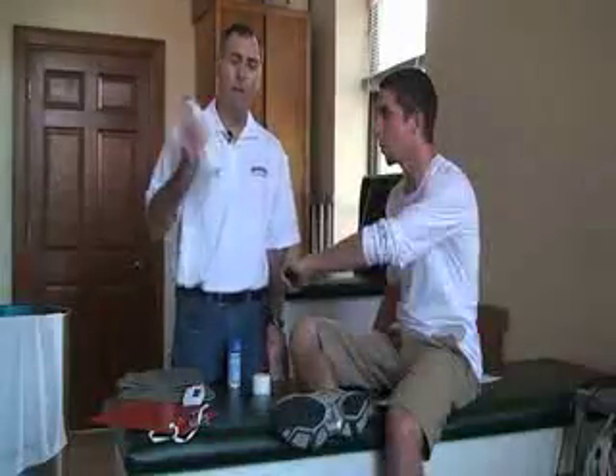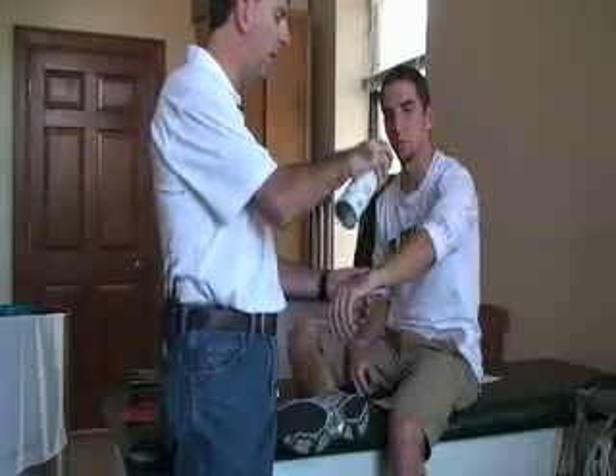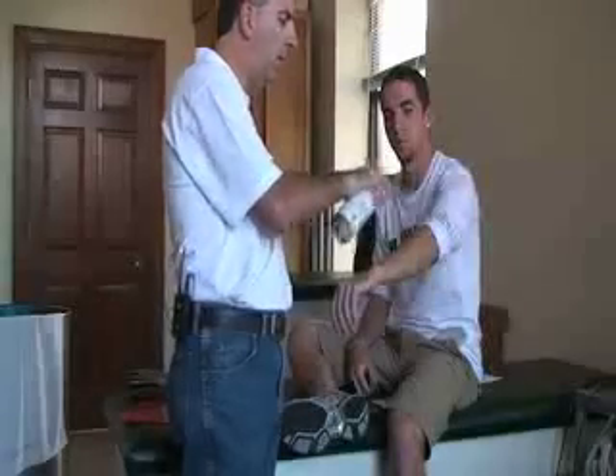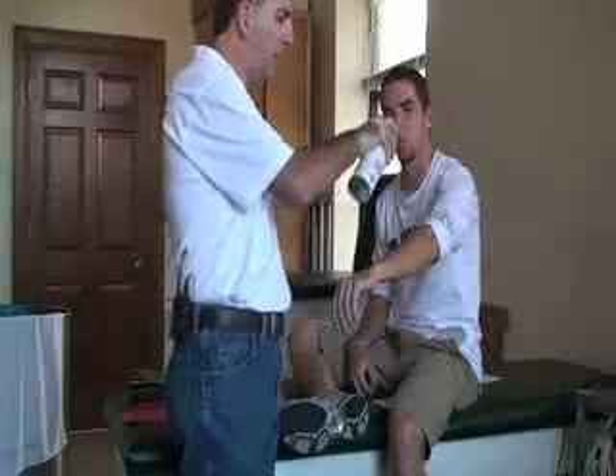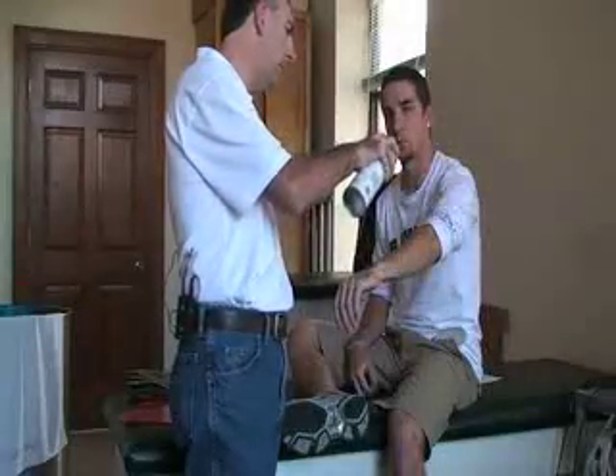After we take the top off, we're going to shake the container. Make sure you're about six inches away and spray it either longitudinally or horizontally. Just make sure that you're keeping it moving and keep it at least six inches away from the body part.